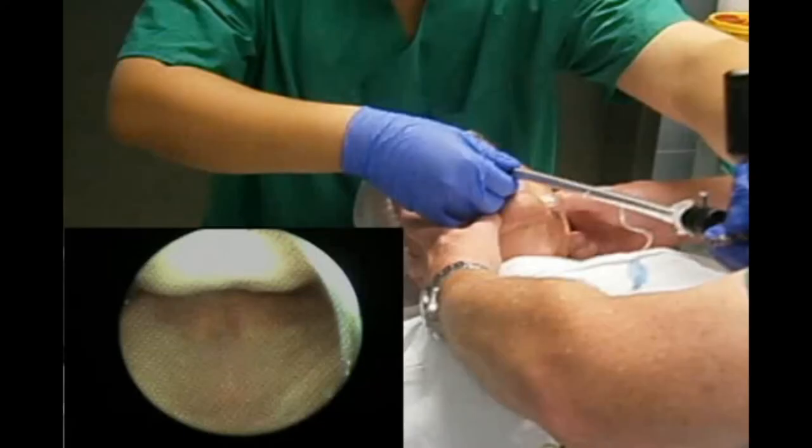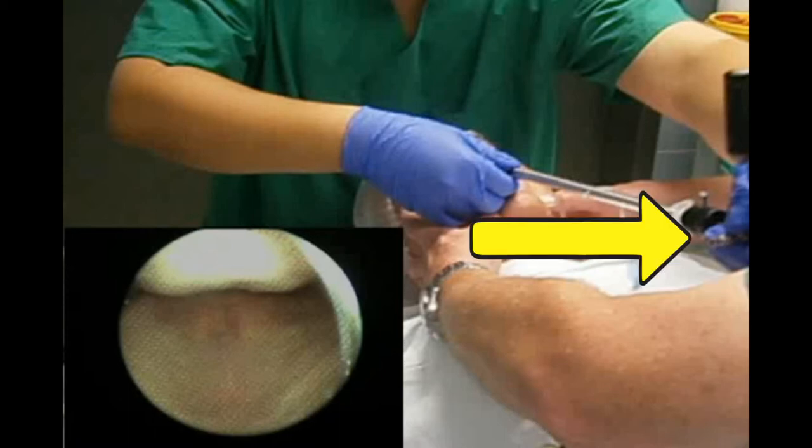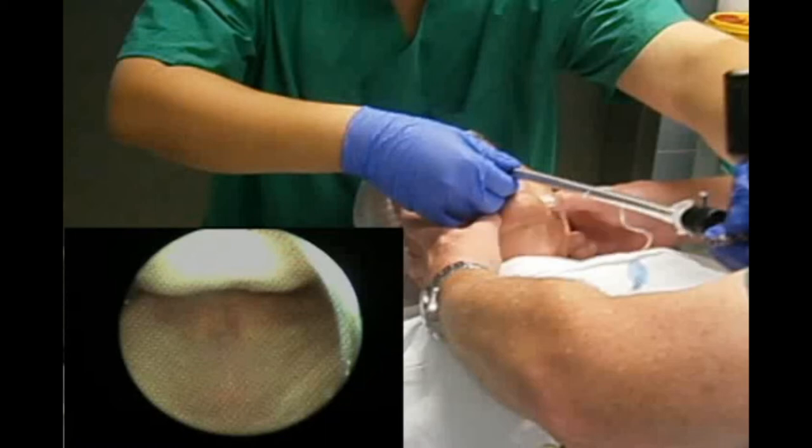The easier way of using an optical stylet is the midline approach. It is the easiest way to learn endoscopy with the Bonefills. If you're a beginner, hold the scope with your dominant hand — it is easier to learn control this way. You could use either hand once you're an expert. Perform a jaw thrust. When starting, it is easier if someone else performs the jaw thrust, so you can focus your effort on the actual endoscopy.